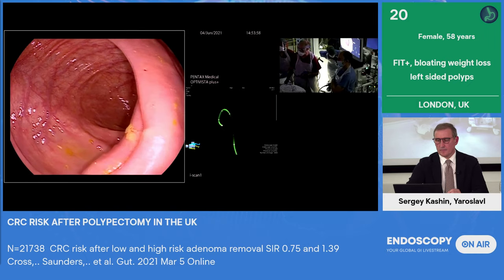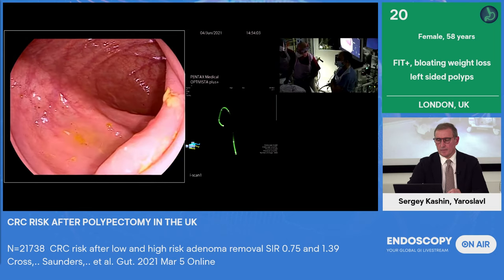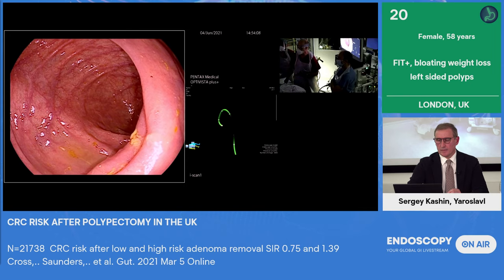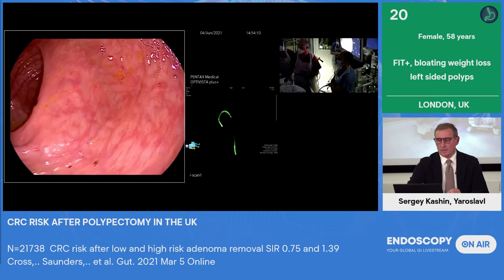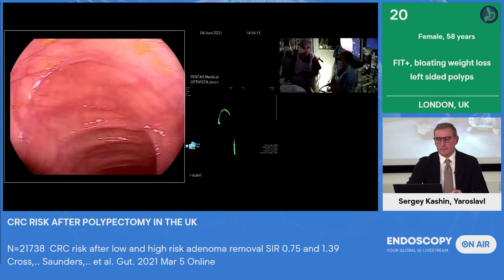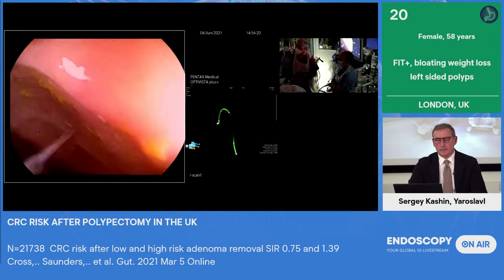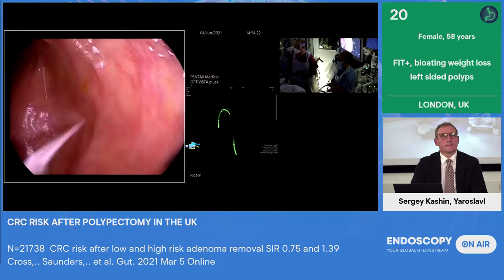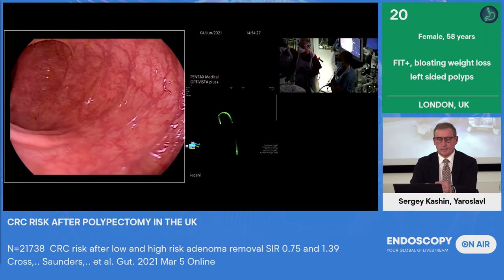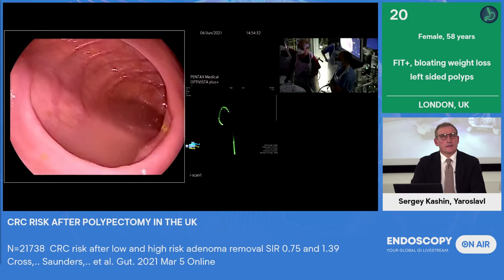There, it's sort of flashing, slightly picking up the ileocecal valve. What you notice though is it doesn't stay fixed on the valve. Once we move away from it, it's not showing an abnormality there. Now I'm starting my withdrawal on the way back, and we're just gradually having a look round. The washing pump is just such an advantage nowadays. With the scope, we can clean and wash as we go. The capsule didn't show any abnormality in this proximal colon. We've of course got carbon dioxide to look.